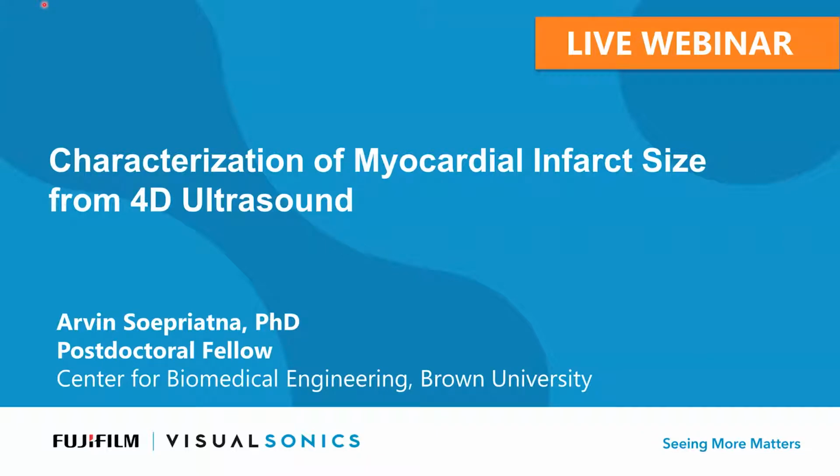I'm the scientific liaison here at Fujifilm Visual Sonics, and I'm very happy to present a webinar today by Dr. Arvin Soepriatna. He is a postdoctoral fellow at the Center of Biomedical Engineering at Brown University, and he's going to be discussing the characterization of myocardial infarct size using 4D ultrasound.